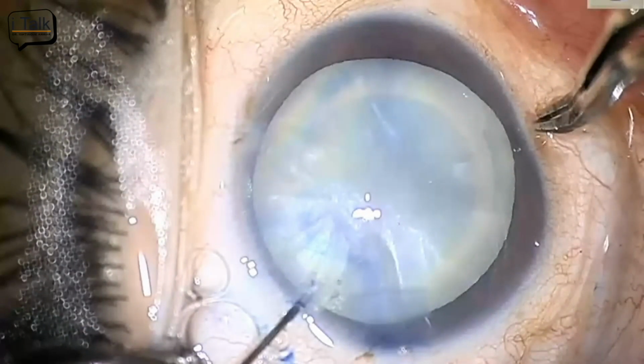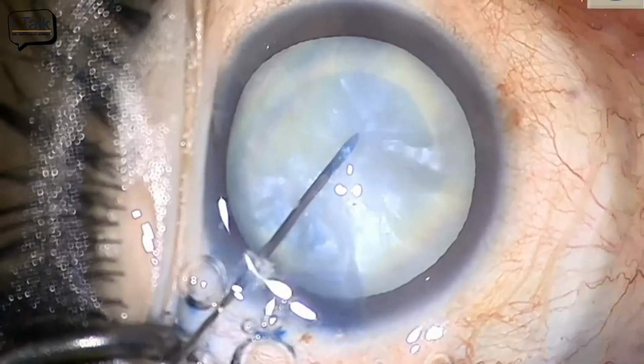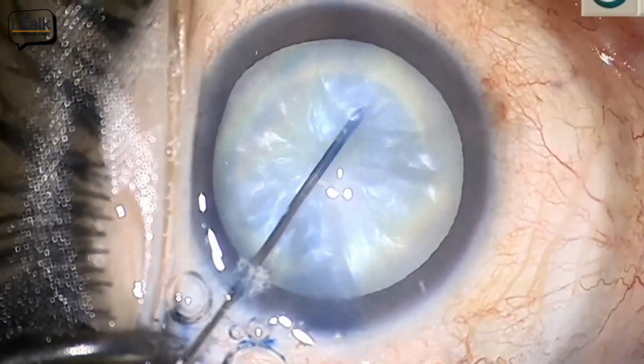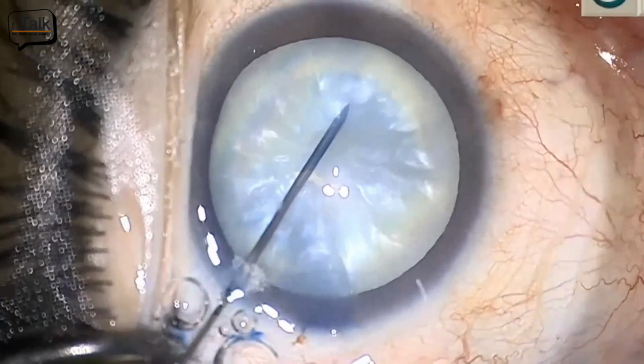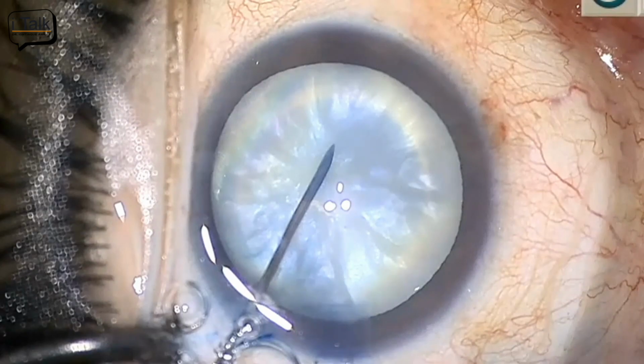And another thing which I would have done, which I do nowadays, is that once I have decompressed in the center, I'll just run that video. Yeah, this is the ideal thing that you want to show us. Yeah, so if you just narrate. So I'm going through with a 30 gauge needle. So can you pause it? So with this 30 gauge needle or the 26 gauge needle, I decide.